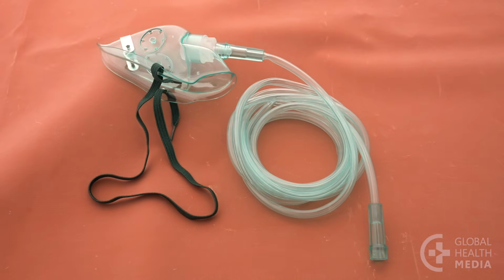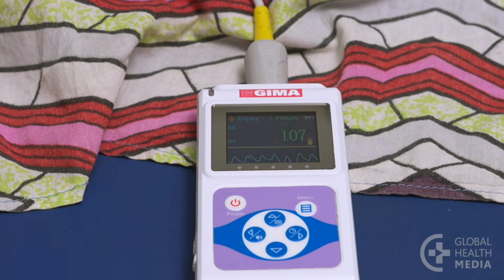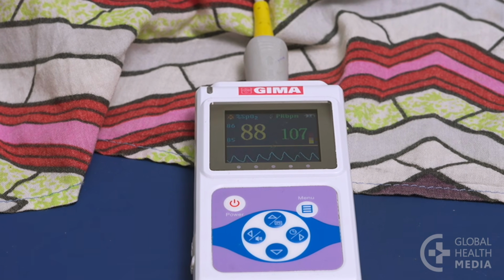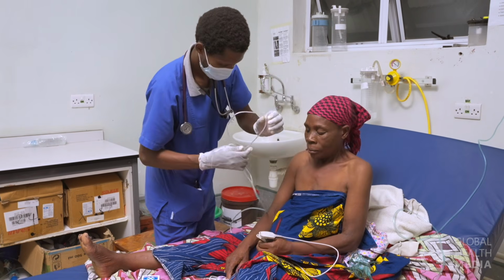The face mask. If after 5 minutes with a nasal cannula, breathing has not improved, or the oxygen level is still less than 92%, change to a simple face mask.